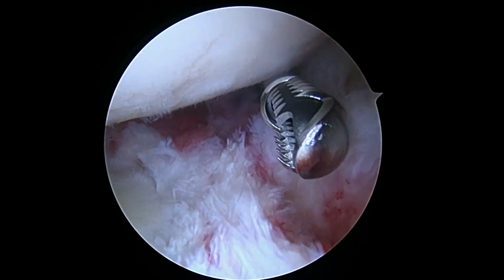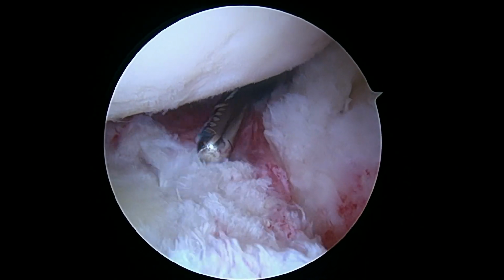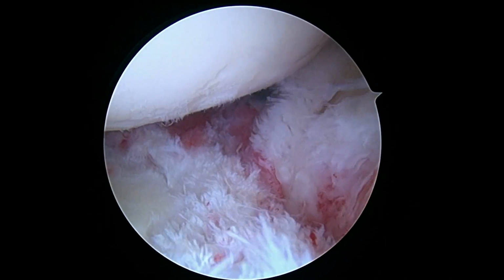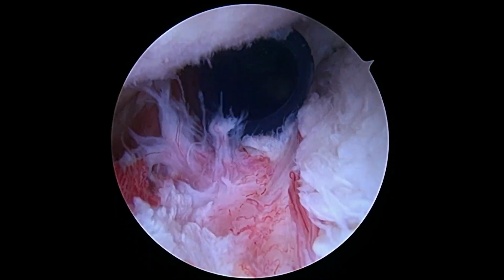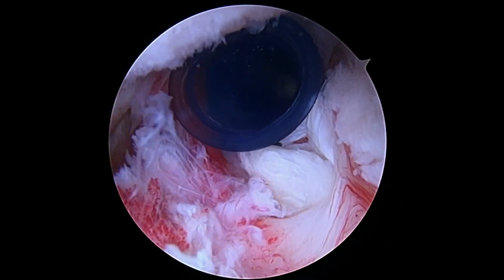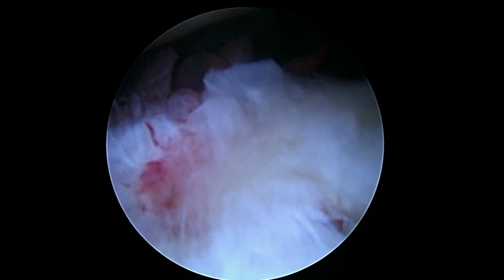Okay, so we're done with the biceps tenotomy, which means we release the biceps. We passed a stitch through it first so we can later reattach it. I don't think we can even see the edge of it. It kind of retracted a little bit. But yeah, so there's the edge of the biceps right back there, and when I pull on it, you can see it move. So we're going to go ahead and get to work now on the rotator cuff and the rest of the shoulder stuff that we have to get done for you today.